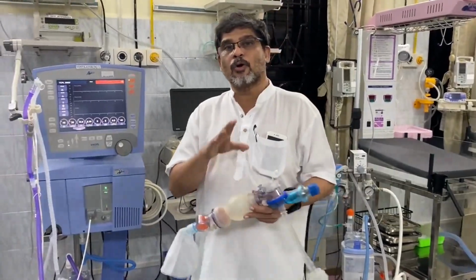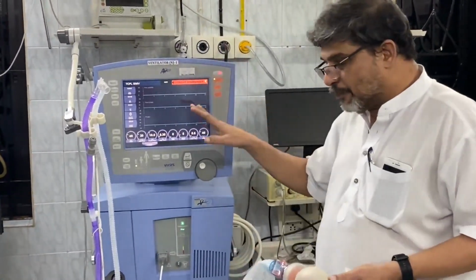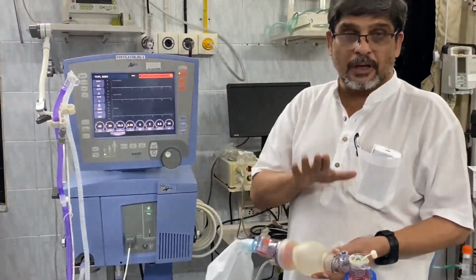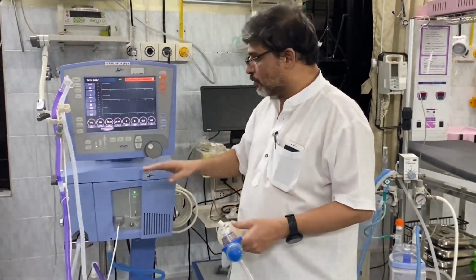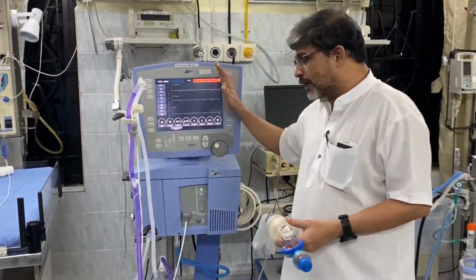So don't get overawed with the situation. Don't get overawed with the graphics and lot of things on the ventilator. If you know the basics, you can ventilate. Anyone can ventilate on this ventilator. The second most important thing is that whenever you are ventilating, even with a bag and mask or a ventilator, your best parameter to gauge is the patient. Have a look at the patient, don't have a look at the monitors.